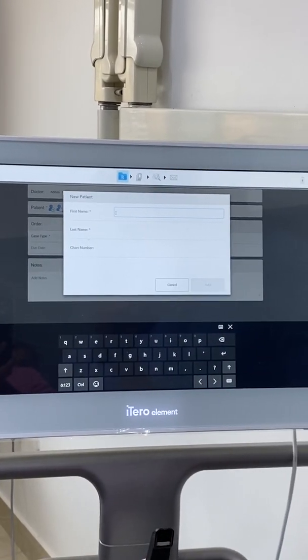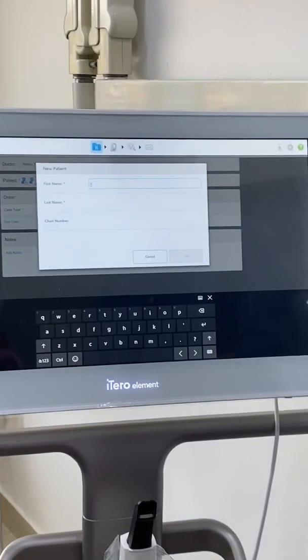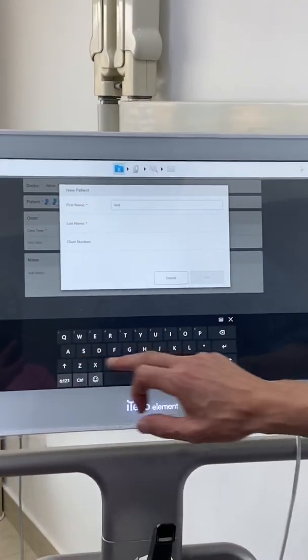Would it be the same one, the same patient? No, we will try the Flavy first. Okay, so this will be a test. So we'll just call it.